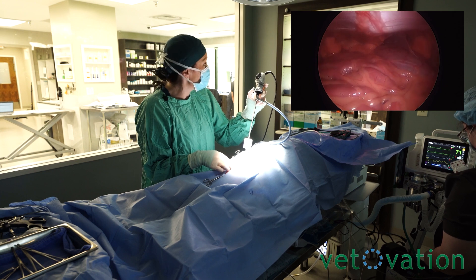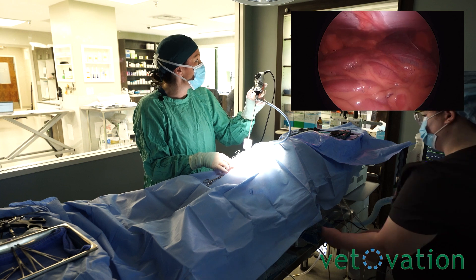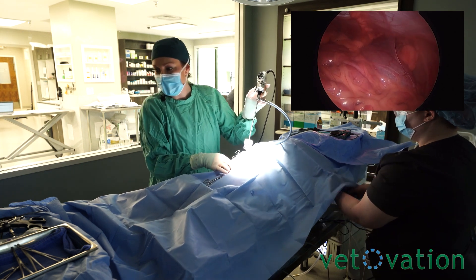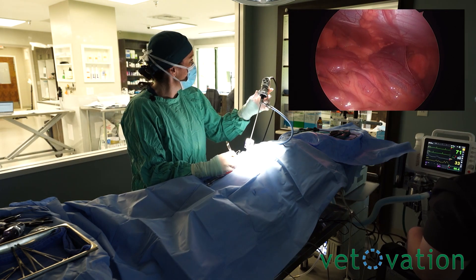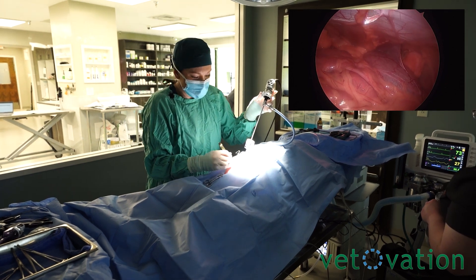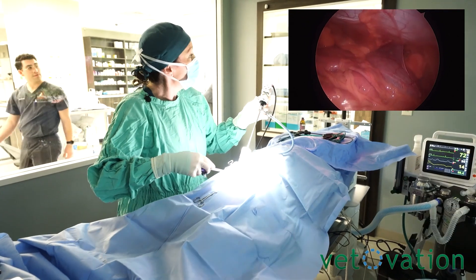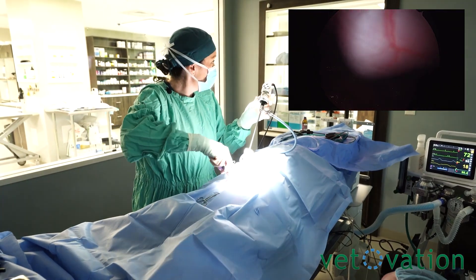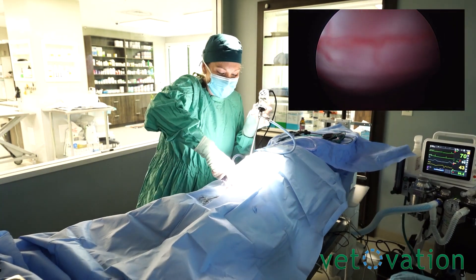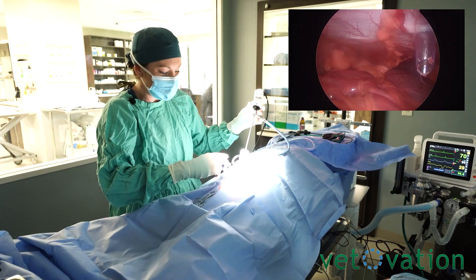For her, especially because we are concerned about a pyometra, we're going to go right here so we can see our finger. We can feel the linea with your finger too. We can see our scalpel blade going in. If you don't get it directly on the linea, the beauty of muscle is it will close right back up.